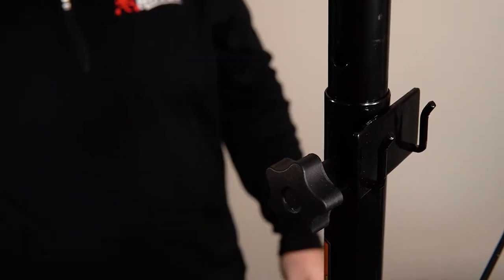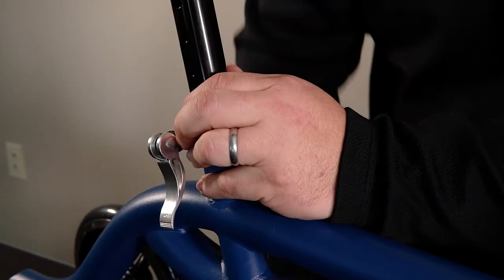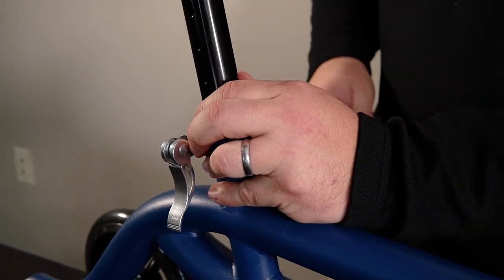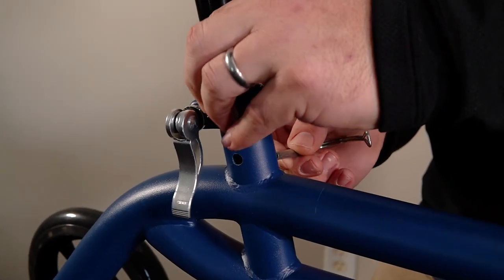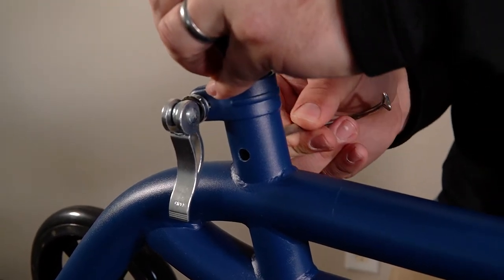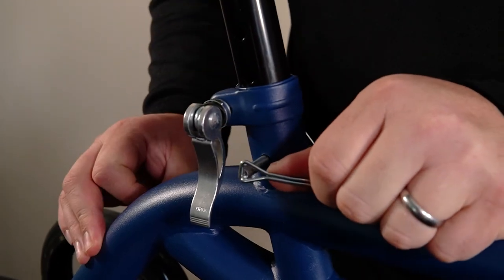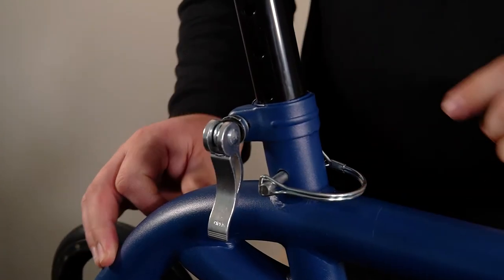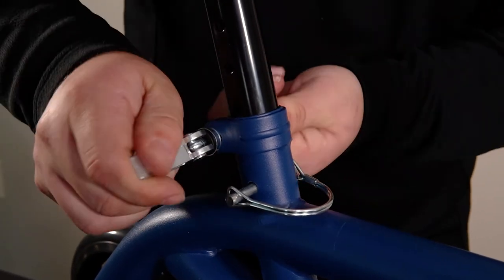Alright, so step number four, we're going to drop the seat into the hole here. You're going to select your desired height, take your locking pin, put it into position, bring it around, and secure it on the opposite side. Then take this quick release lever here and clamp it over.